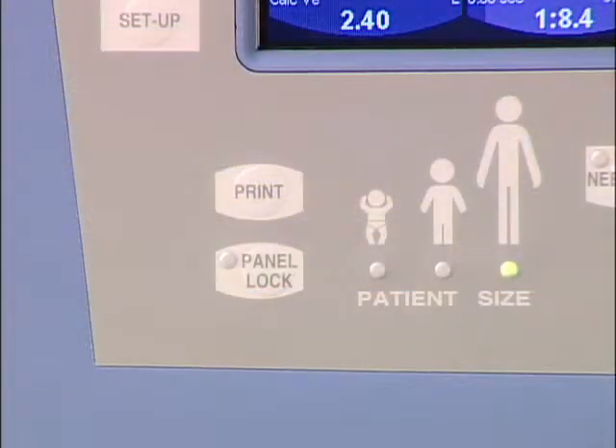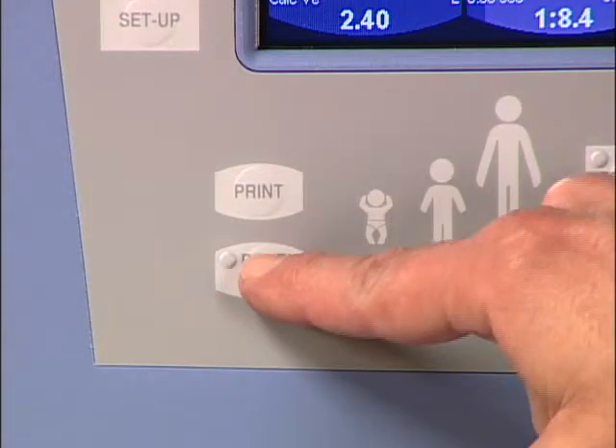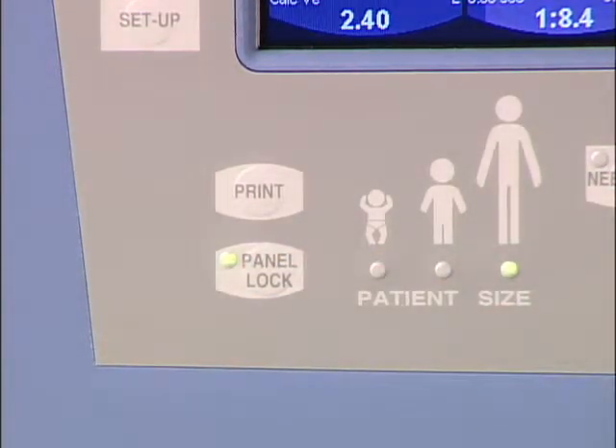The print button sends the currently displayed screen data to a compatible printer. Any screen display can be printed. The lock button will lock all panel and screen controls except for manual breath, suction, increase O2, alarm reset, and alarm silence. To unlock the screen, press the lock button again.